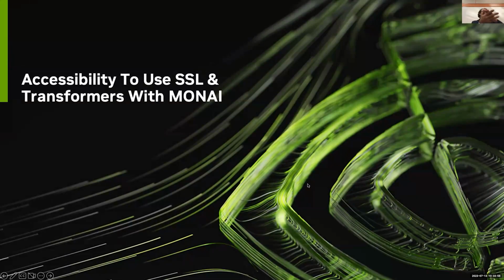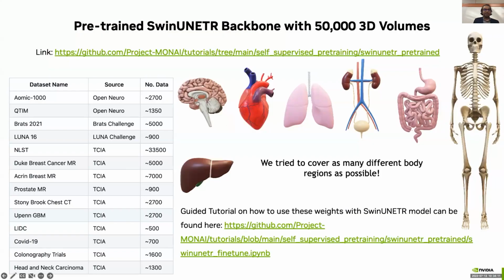Now, I've mentioned a bunch of papers and everything. I'll just briefly touch base on how to use self-supervised learning and transformers with MONAI. We recently pre-trained a Swin UNETR backbone with 50,000 3D volumes. On the left-hand side, you can see all the open source datasets that we've released. Of course, these slides will be released, so you can check out these links yourself. We tried to cover as many organs as possible. There's also a guided tutorial, just using the Beyond the Cranial Vault challenge, to use these pre-trained weights via self-supervised learning. I encourage you all to try it, and if you break it, please reach out. We'd be happy to improve it and provide more support.